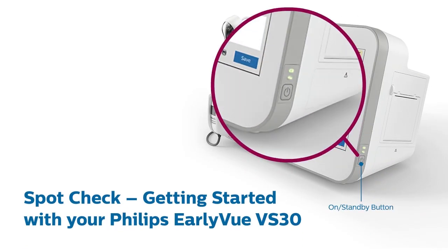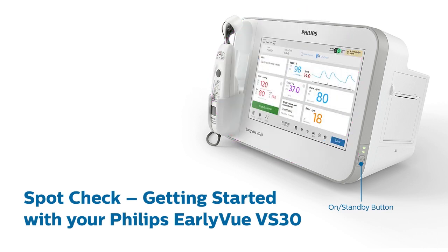Turn on the monitor by pressing the on or standby button. If a power cord is connected, confirm that the AC power LED lights up green and that the charging LED indicates the status of the battery. The monitor will automatically turn on and perform a self-test.